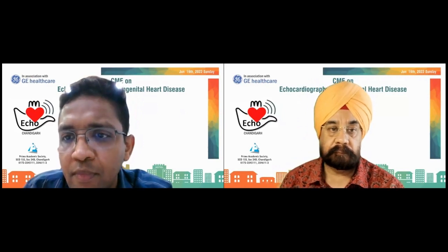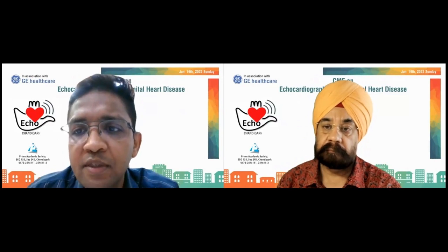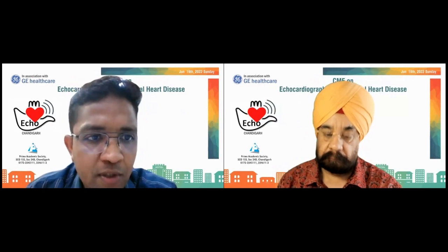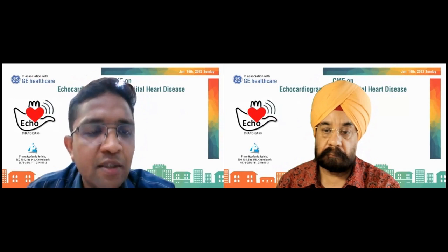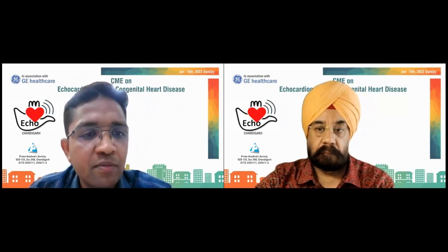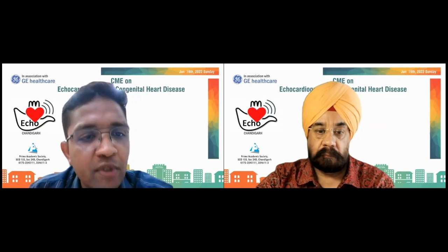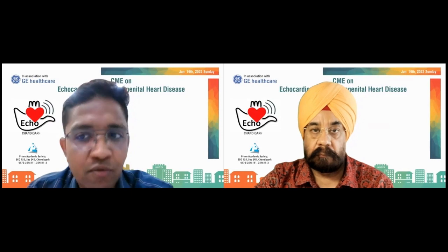So I can see questions here. Is the calculation of QP/QS required while reporting VSD, especially in adult patients? So we don't actually calculate the QP/QS, but we have to give the idea whether QP is increased or not. And this is given by the exact left ventricular dimension and standard deviation score, as I have discussed. Whenever the LV is dilated, it means the shunting is more than 1.5 or 2:1. And if the LV is not increased, it means the QP/QS is insignificantly increased. So we always give the left ventricular end-diastolic dimension and its Z-score. We don't give actual QP and QS.